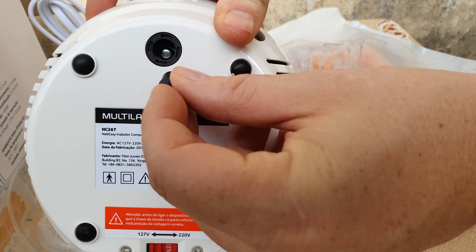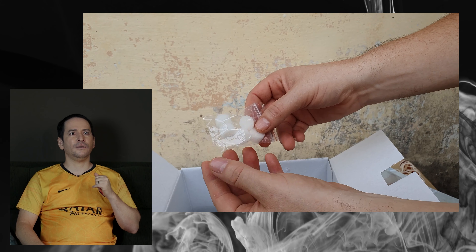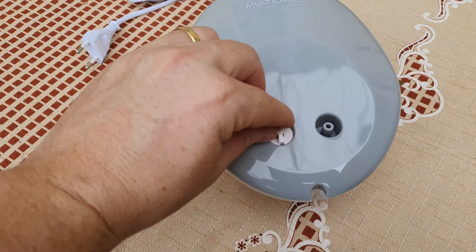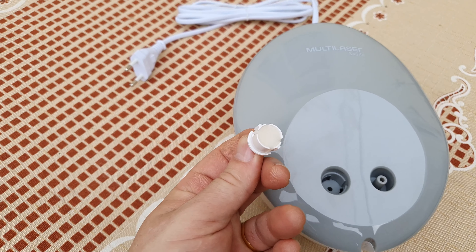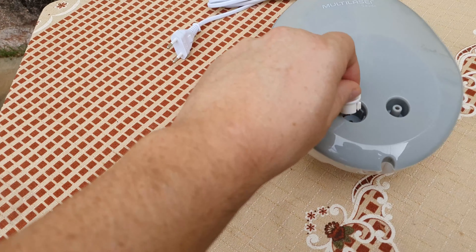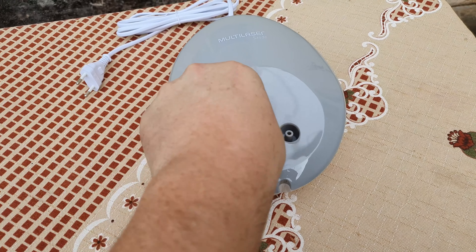Outra coisa muito legal é que ele vem com peças de reposição. Vem com a esponjinha do filtro — vieram várias — e com o fusível de reserva. É muito bacana da parte da Multilaser ter trazido isso para nós. O filtro é muito fácil de tirar, e tem essa esponjinha que ajuda na limpeza e higienização do filtro para garantir maior eficiência no ar. Todo aparelho que tem ar é interessante ter um filtro para que o ar respirável passe por ele para melhor desempenho do medicamento que você está utilizando.